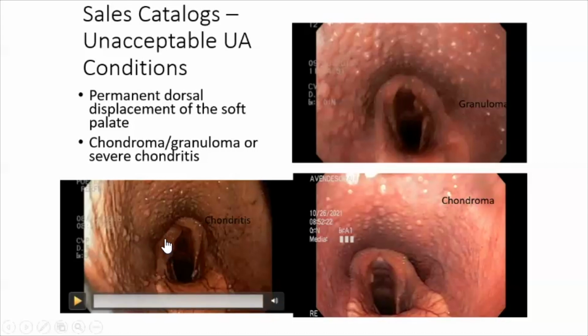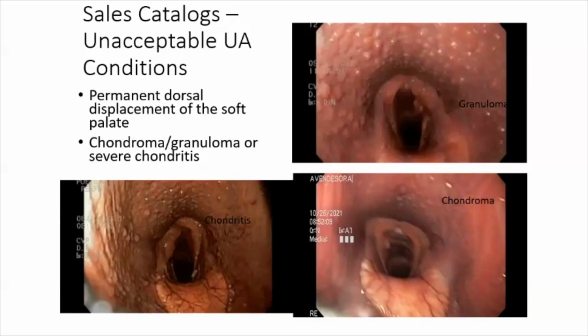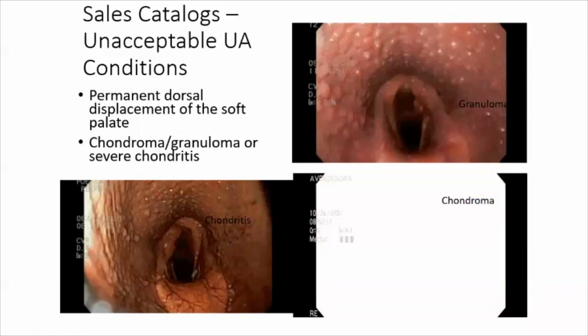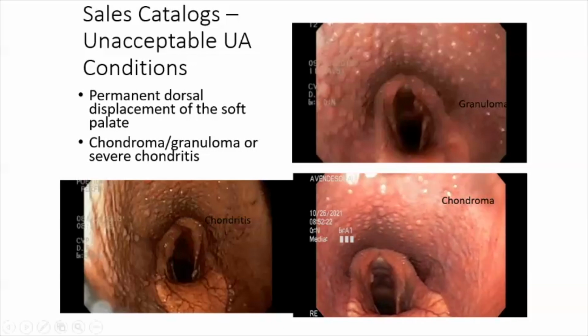likely is. If you look in the lower right, where you see the word chondroma in that image, on the right arytenoid there's a little whitish or cream colored bump that sticks into the airway, right about right there. So that would be considered a chondroma, where there's a little swollen area that probably has a little bit of thickened cartilage. Sometimes those can develop into a bad inflammation within the arytenoid cartilage, and so most people would avoid that.